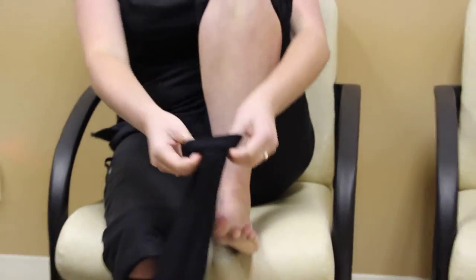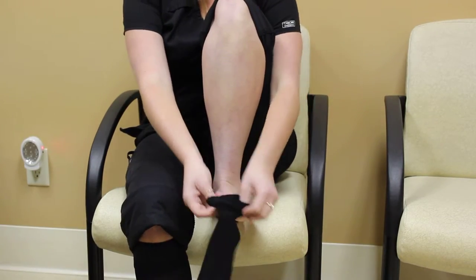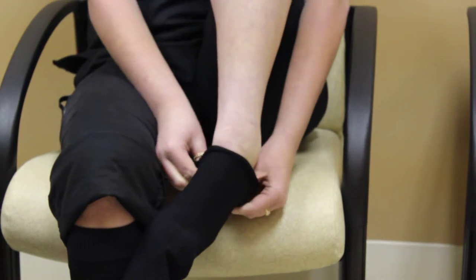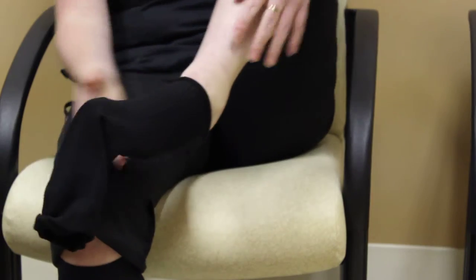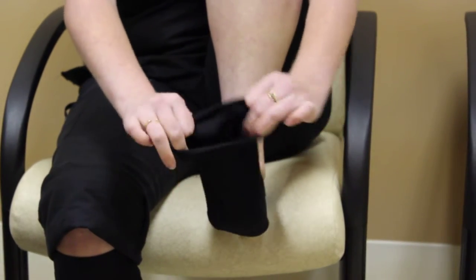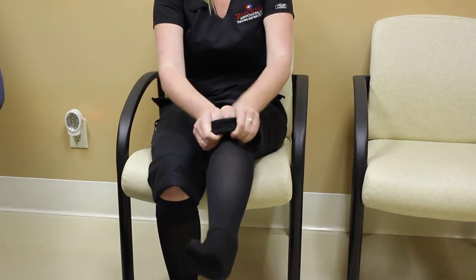When putting them on, you're going to make sure that the heel is on the bottom so it will match up with your heel. You're going to slide your toes in and pull it up. Now your heel is on the back and it matches up with your heel. At this point, you're going to grab the sock, flip it, and pull it all the way up.